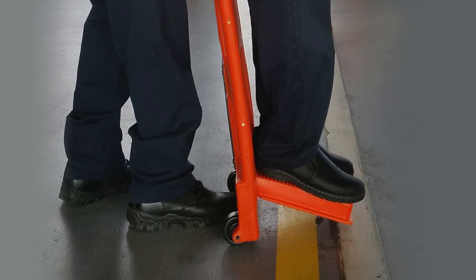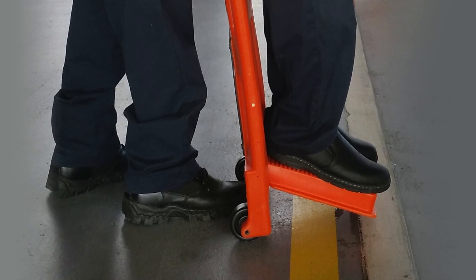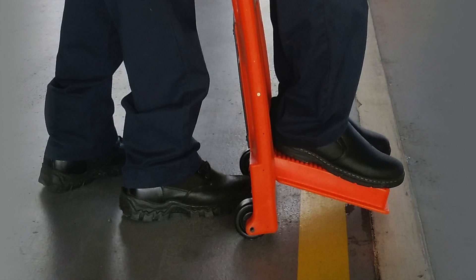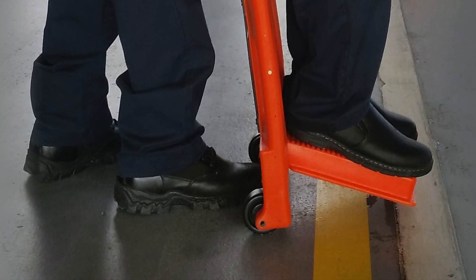The open footrest is strong but flexible by design. When supporting weight, the angle will be greater than 90 degrees. This angle allows for the natural contour of the patient's ankle.